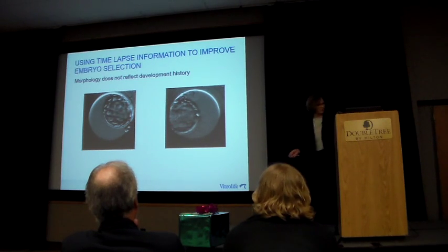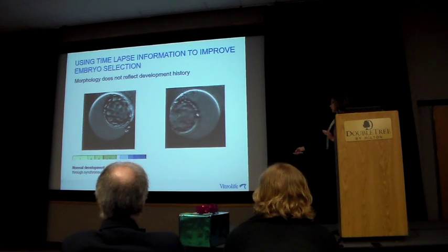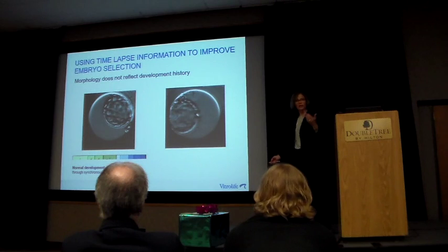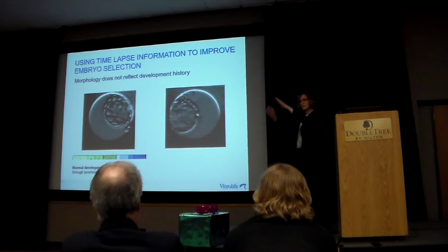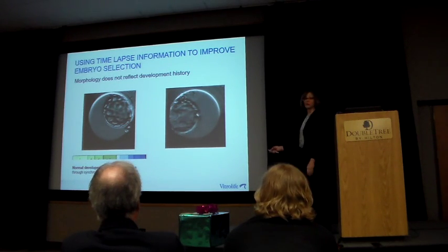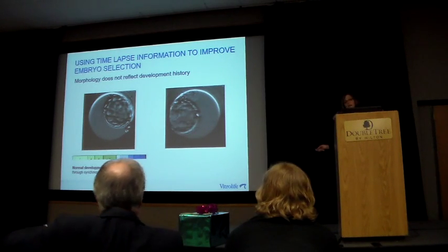And what you see with the tools of that software, it creates this real pretty little color graph. An embryologist that's trained will learn to recognize that pattern as normal. Even from when all 12 of those embryos were on the screen at once, you can go, oh, that's a normal pattern. Whereas this one would have been that second video.